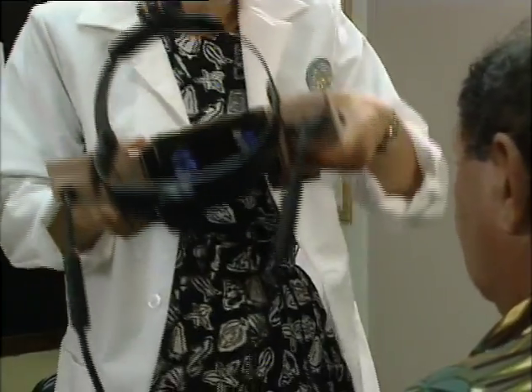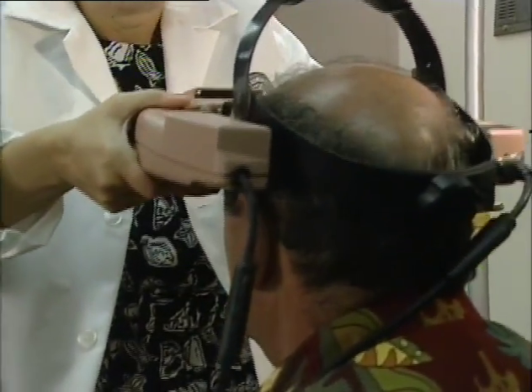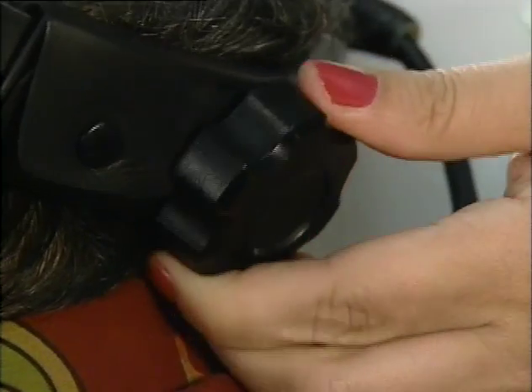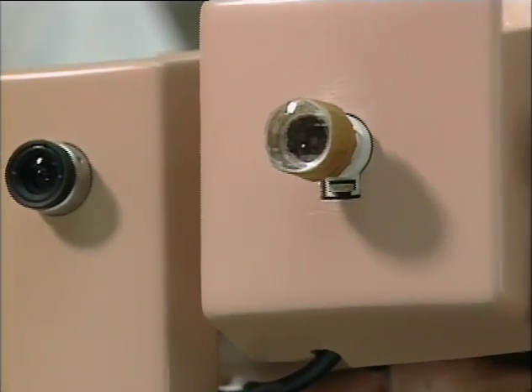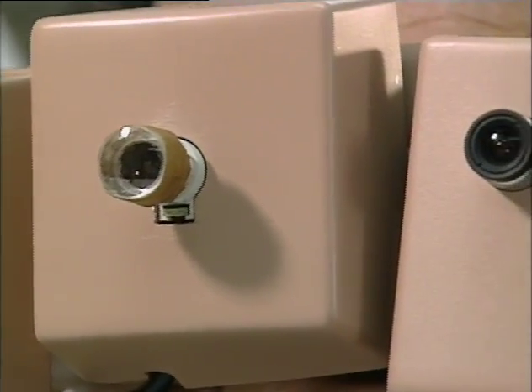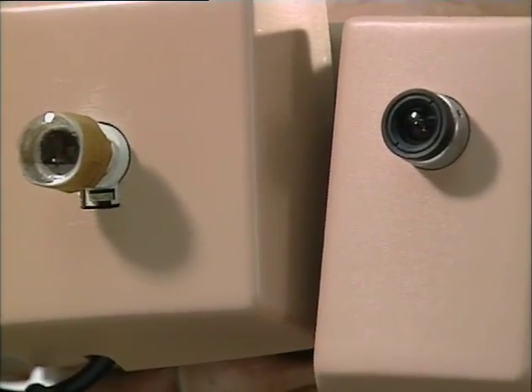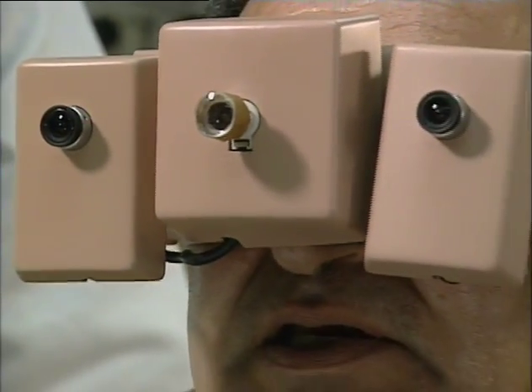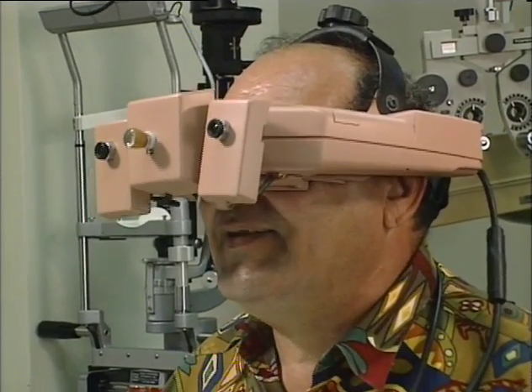Joan Stelmack is an optometrist at the Hines VA Hospital near Chicago. Leonard is trying the helmet for the first time. The system uses a TV camera to view the world, then processes the scene electronically. In the simplest mode, Leonard sees images that are like conventional magnification aids, only wider. It's convenient, and it works. R, R, D, F, U, V, U, R, Z, V, H. I can see. I can see.